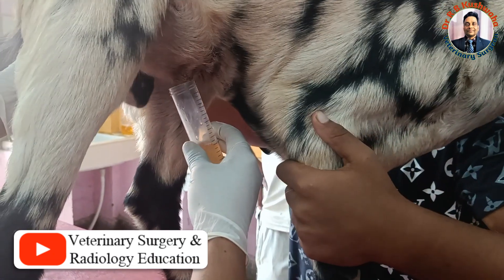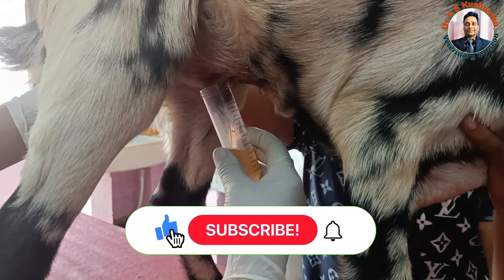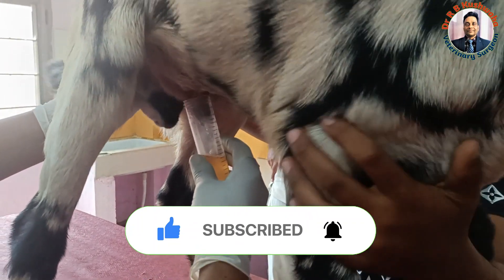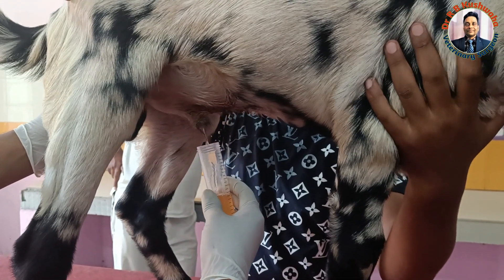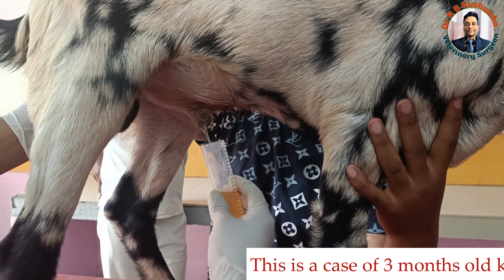This is a three-month-old kid presented to the clinic with a history of complete obstruction of urine. We have just performed the urethral process excision, and now you could see that after doing the urethral process excision, urine flow has started.